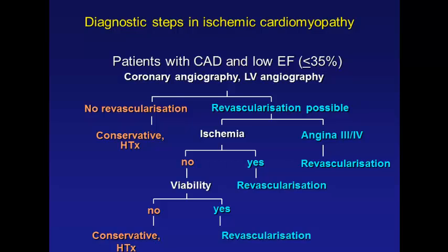They send me patients with open coronary arteries, and I must tell them, look, this is not a good indication, because the aim of that evaluation is to decide to open an occluded artery. And if the artery is already open, there is little we can do. Now, we have to look for patients with reduced ejection fraction, and we do have to look for patients who technically can be revascularized. If the interventionalist and the surgeons tell us we cannot touch this patient, then there is no way of doing further evaluation.